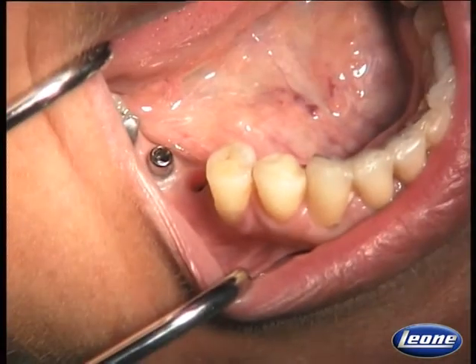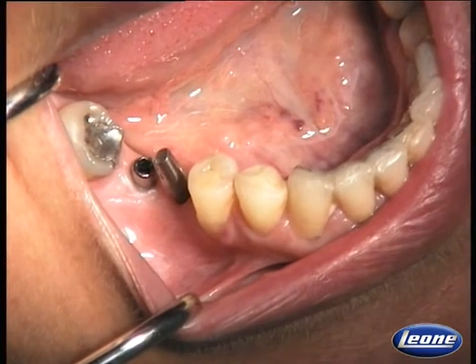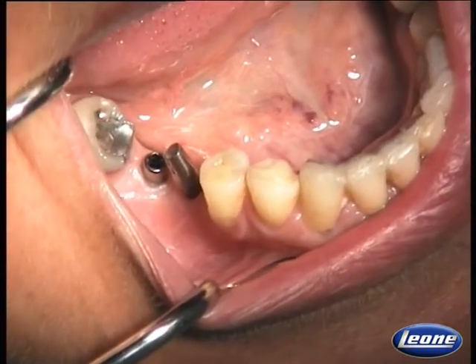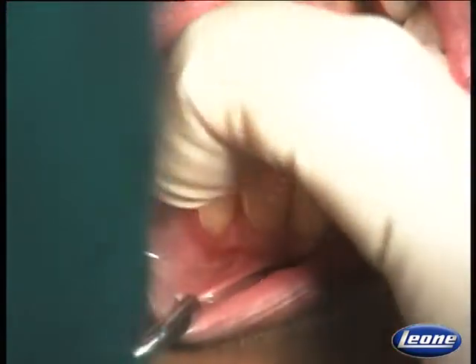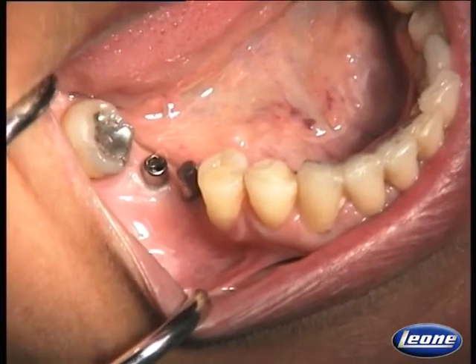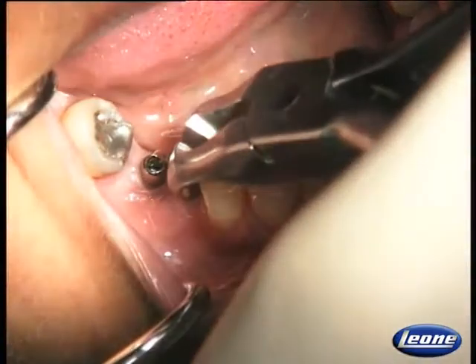At this point, we take the first abutment and place it into the implant. The position of the orientation dots has to be in the same position in the mouth as they were on the model. After having found the inner hex, I push the abutment all the way down and exert a finger pressure on it. Now the abutment has already a good retention, and I can do a precise metal try-in.